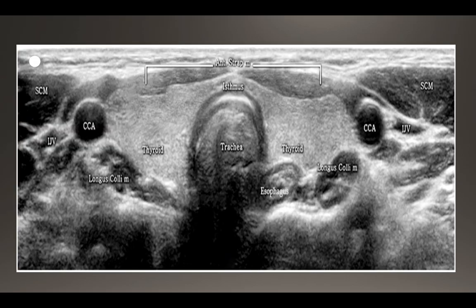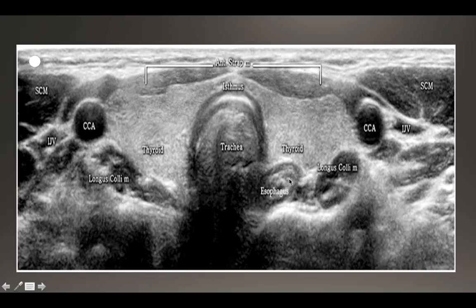Here's a look at the thyroid in a transverse plane. This image is helpful for orienting ourselves with the major structures. Midline we have the thyroid isthmus and then the left and right lobes. Remember the indicator is to the patient's right. We have the right and left lobes, and posterior to the isthmus we have the trachea and the esophagus, often described as having a bullseye appearance because of the lumen with the surrounding musculature. Laterally we have the common carotid artery, the internal jugular vein, and then some of our neck muscles — the strap muscles and the sternocleidomastoid.